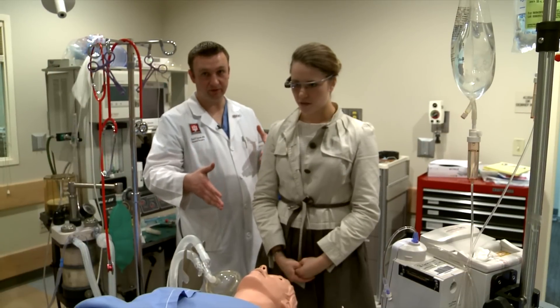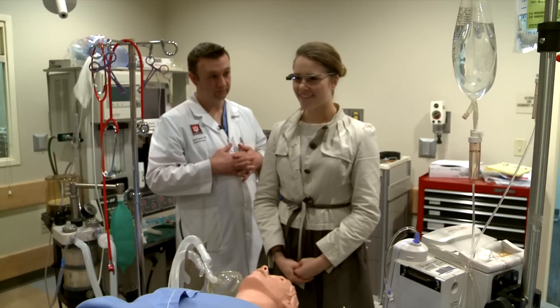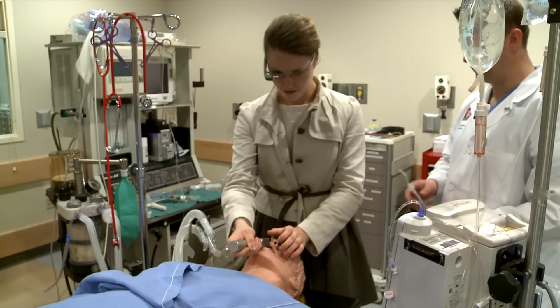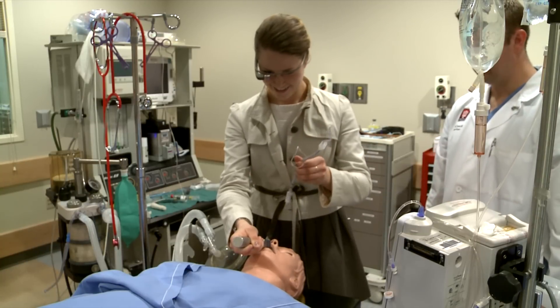So you're being able to look at the patient and see everything that I saw when I did that. From there, I was able to see the steps more clearly. Then I replayed the video as I attempted to intubate the victim a second time. Put that tube in the right spot.